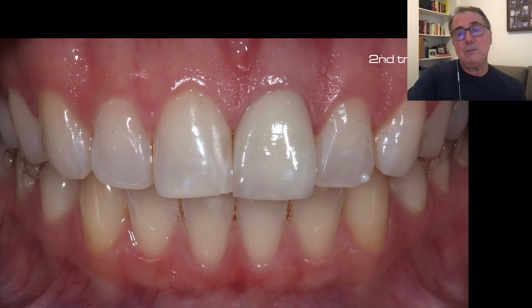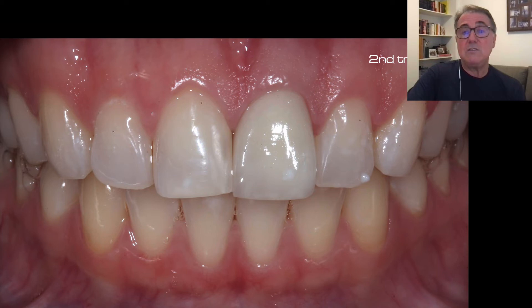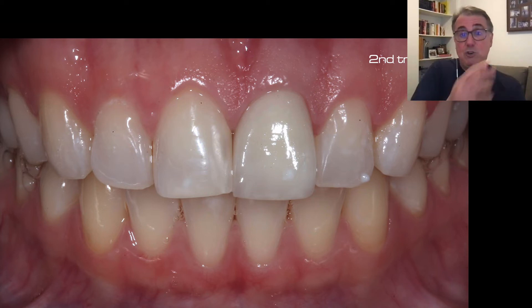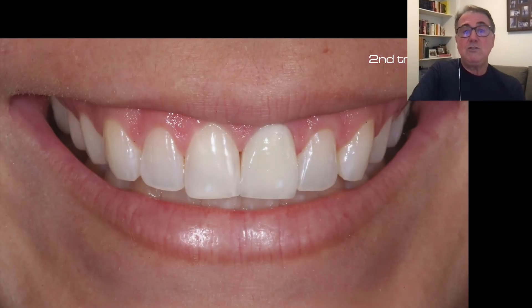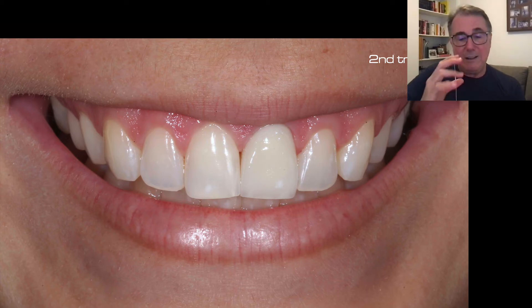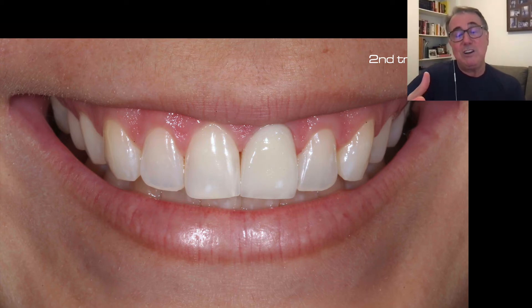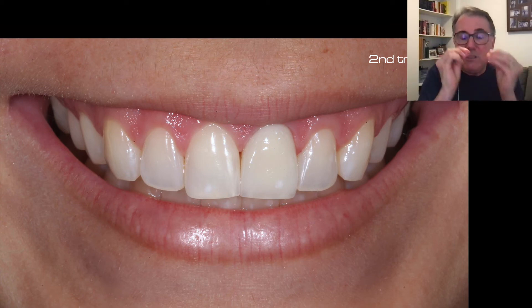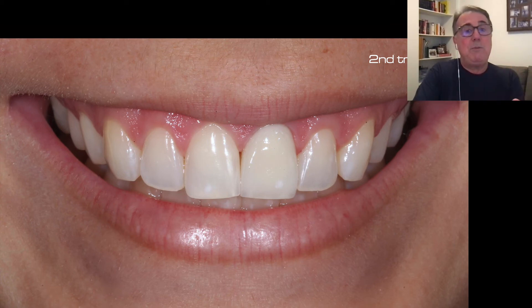This is the second veneer — it looks a lot nicer. I needed to use a very opaque trying paste to confirm that the result is now much better. I don't think we can get a much better result than this one here. It's never exactly perfect, but it's very close, and the patient was happy about it.